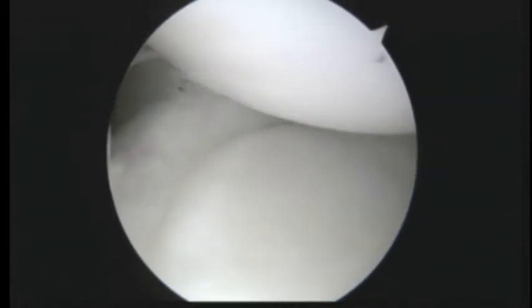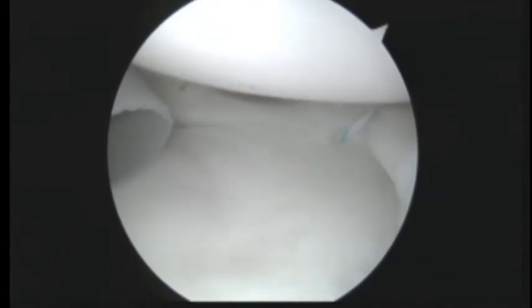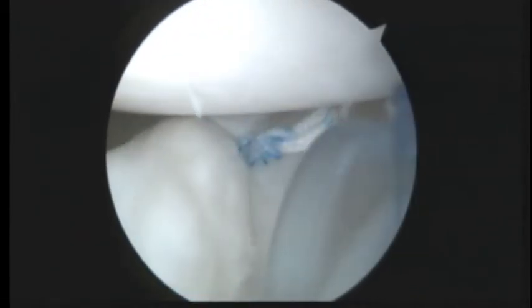Good. So now let's look inside the joint, and you can see we've got two kind of evenly spaced sutures, basically one at 5 o'clock, one at 7 o'clock, and it's really tightened down the inferior recess, which is what we wanted. That ligament's the one that's really important for shoulder stability, the one at the bottom that runs between 5 and 7 o'clock.